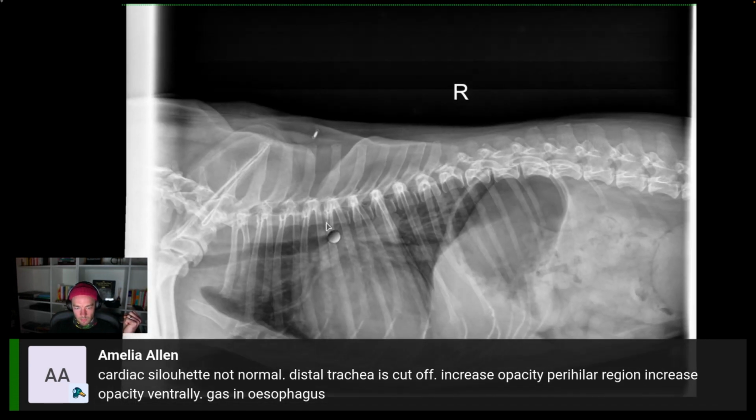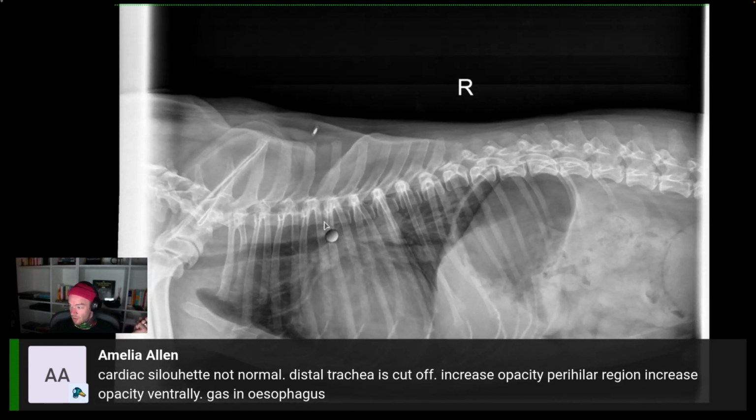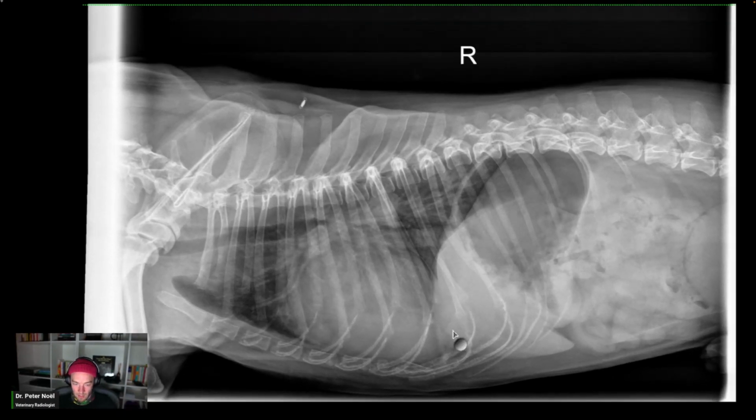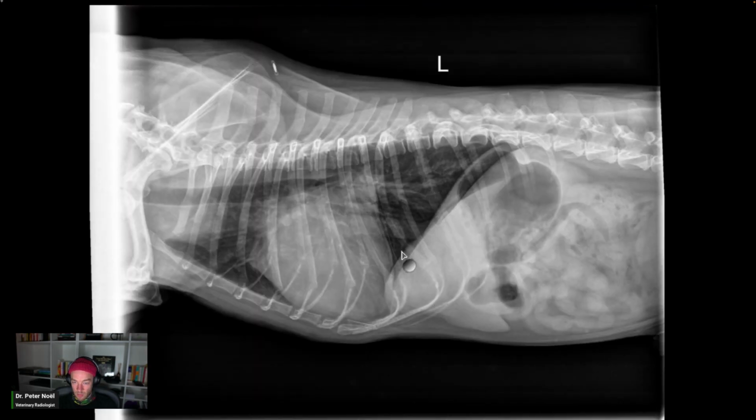So okay, first thing I start with is usually the cardiac silhouette, right? This patient has cardiomegaly. If you follow, first of all, it's expiratory. I think we talked about the accessory lung lobe will sit in this area and it looks like a piece of pizza. And this is a fairly small piece of pizza. See how this one's bigger?